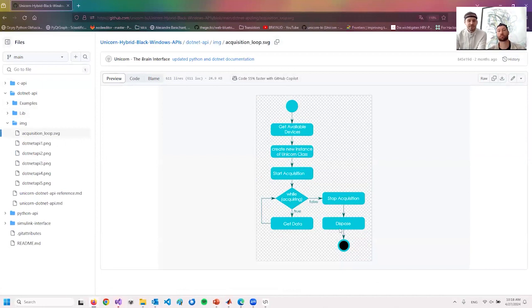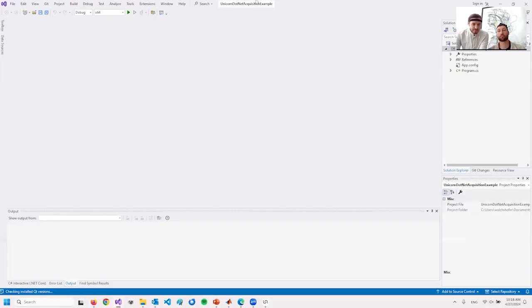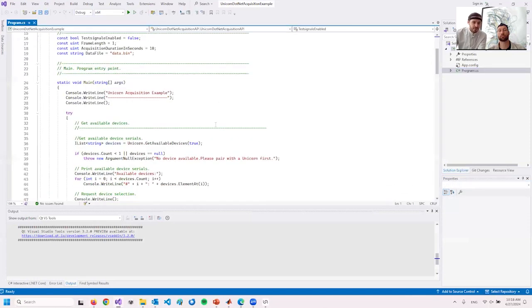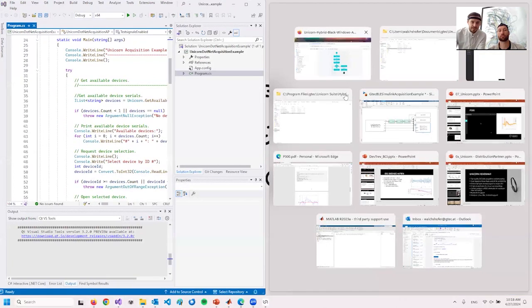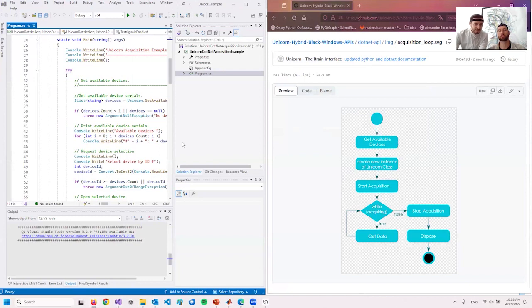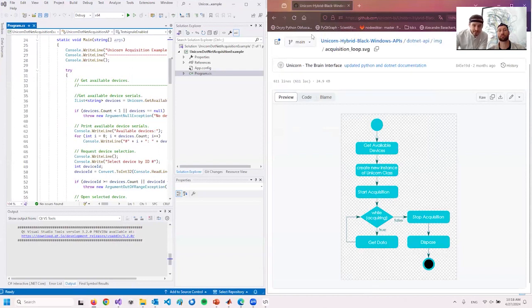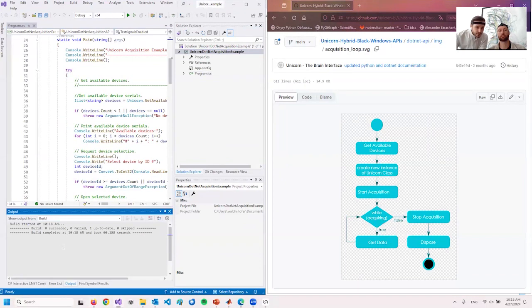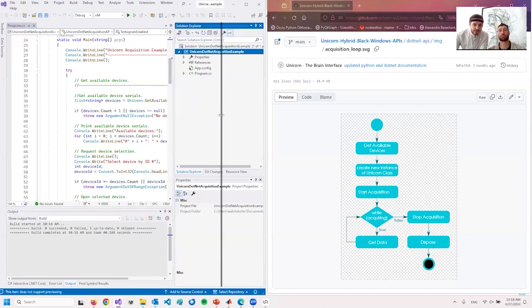And when we're done, we're finished. In the meantime, the C# API should have loaded. I can try to build it and give you a short idea of how this acquisition loop would look in code. So maybe we can put it aside. We have the get available devices. Yeah, everything's built. Good. Let's make some space so you can see what I'm looking at.